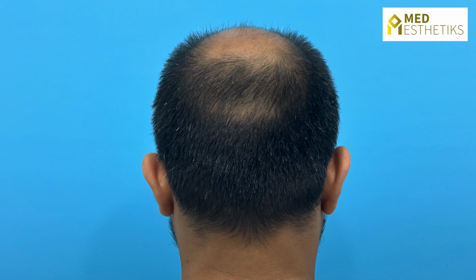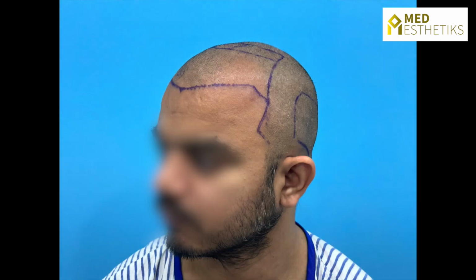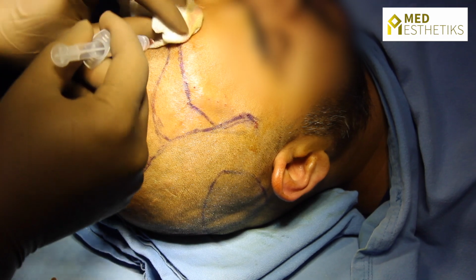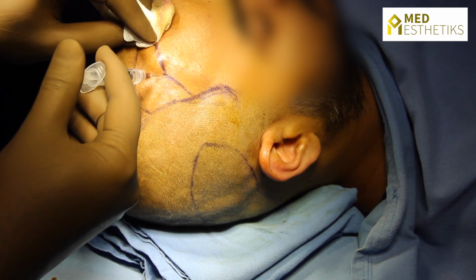Here you can see the pre-operative pictures of the patient in the front profile, in the side profile, and also the donor area. After the markings are done, the shaving of the patient is done and the patient is taken into the operation theatre. Here you can see that we are giving local anesthesia injection in the frontal area.